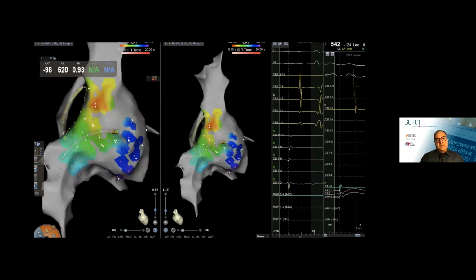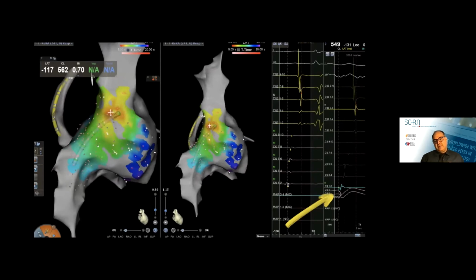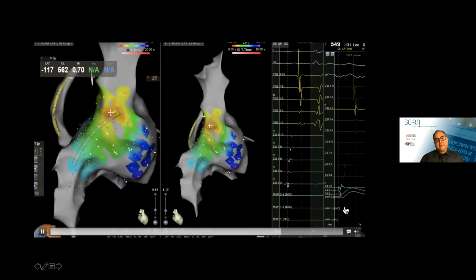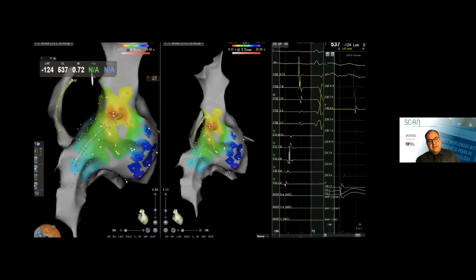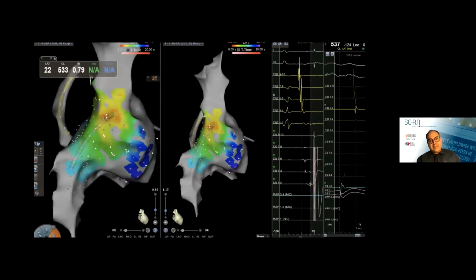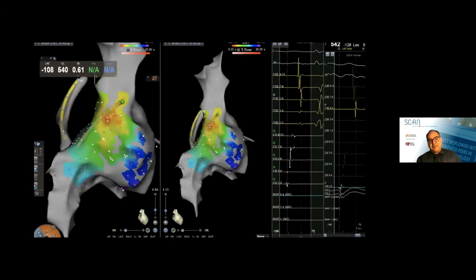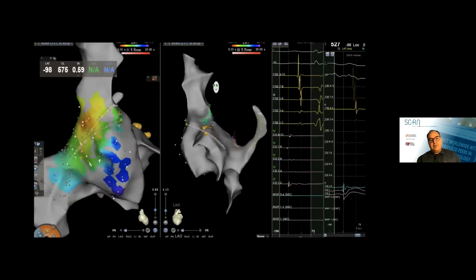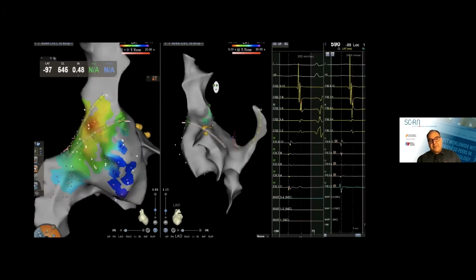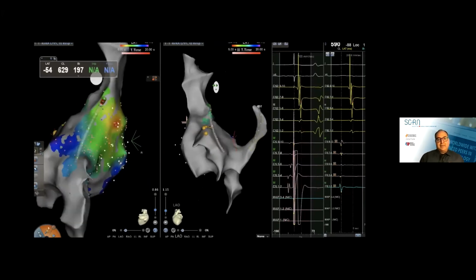And in a second, I'm going to put the tip of the catheter over the earliest activation. And you can look at the unipolar. You can see it's the QS, very nice local activation. So I think there is no doubt that this is a crista atrial tachycardia. The question was, is this clinically relevant or not? The patient was not on isoproterenol. This was continuously reproducible. And the patient had palpitations. So we had no choice but going after this and ablating it.